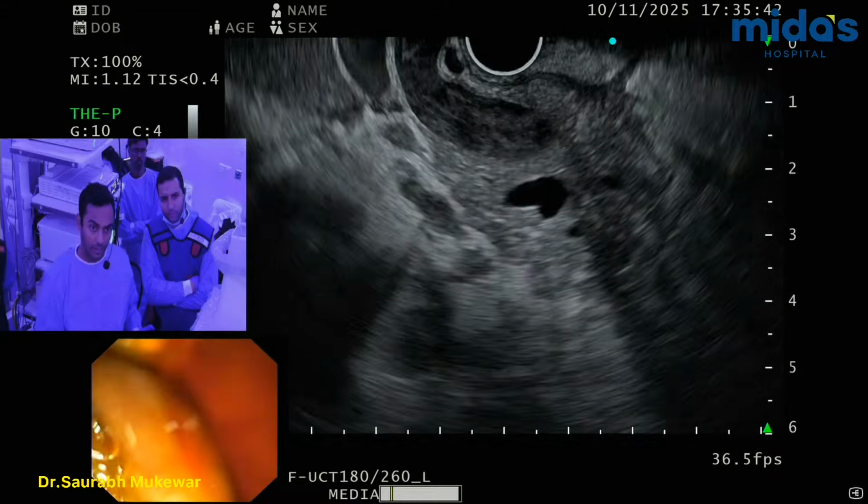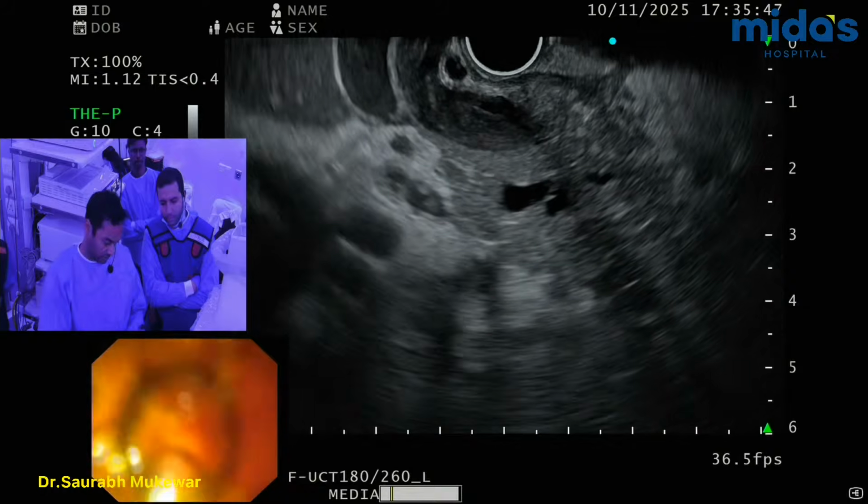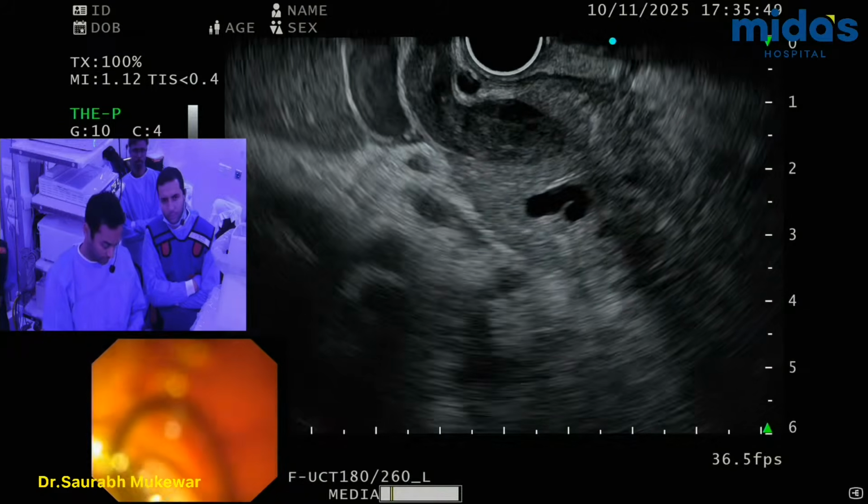Yeah, this is a good angle here, right? Okay. So I'm going to have her, but let the technician come and then we'll.